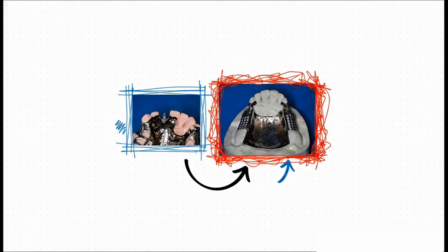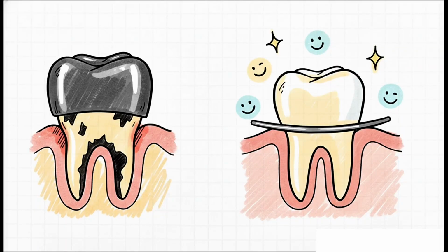A truly great engineer minimizes framework elements and avoids that bulky plating whenever possible to keep the whole prosthesis clean and unobtrusive. So what's the actual biological physics behind avoiding that bulk? Well, whenever you stick extra metal near or right over the gingival margins, your gums, you are basically asking for trouble. It increases plaque accumulation, leads to bleeding, causes a loss of tissue attachment, and drastically spikes the risk of root caries, which are cavities right on the tooth roots. In fact, patients actually prefer a minimalist lingual bar over a bulky plate 3-to-1 just because it's so much more comfortable. Long-term periodontal health is the absolute ultimate goal here.